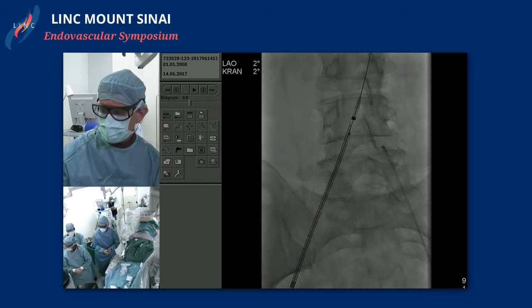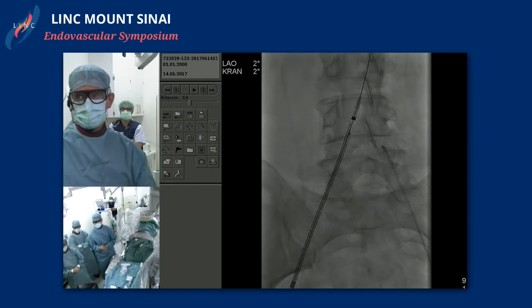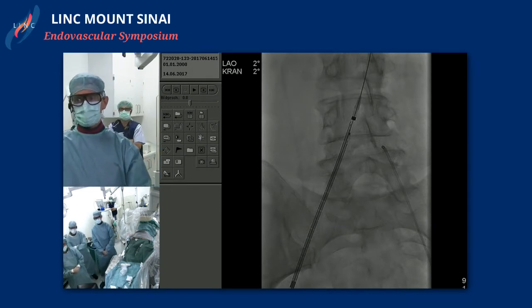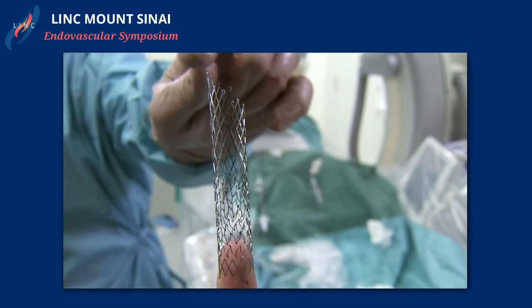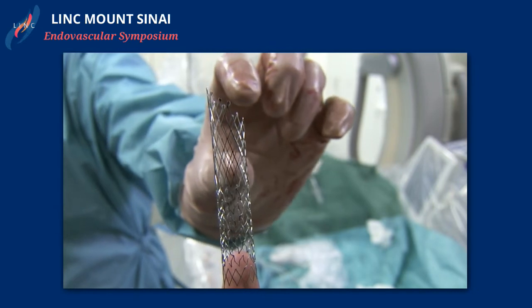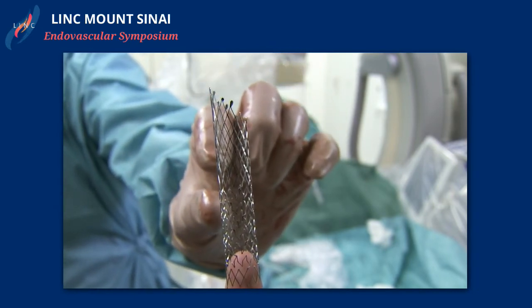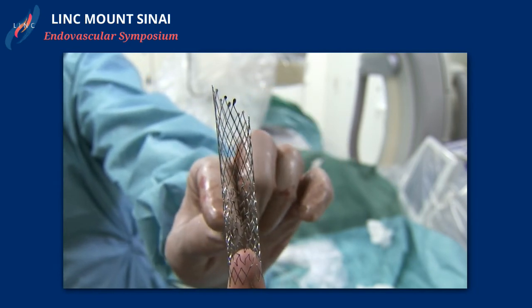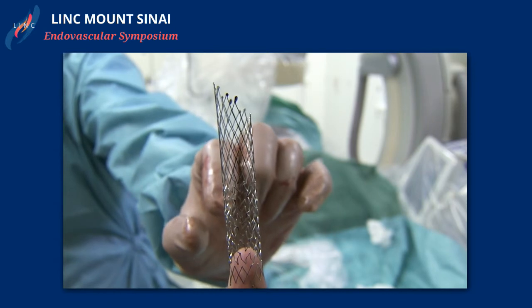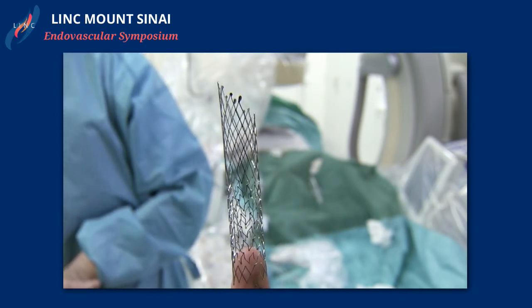Maybe you can show the stent in the camera here. Hopefully you can see this. You can see here these markers, so this is oblique, and then the first part here is closed cell and very strong. And then there are some segments which are open cell and flexible, but the end is again closed cell, and again has very high radial force for the second, so to say, turner point. So that's the design of that stent here.